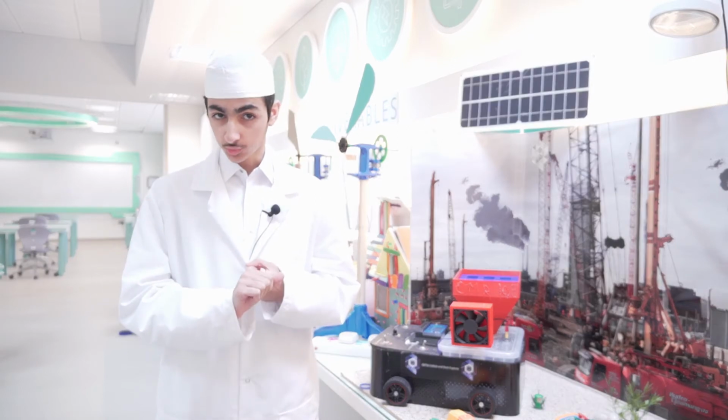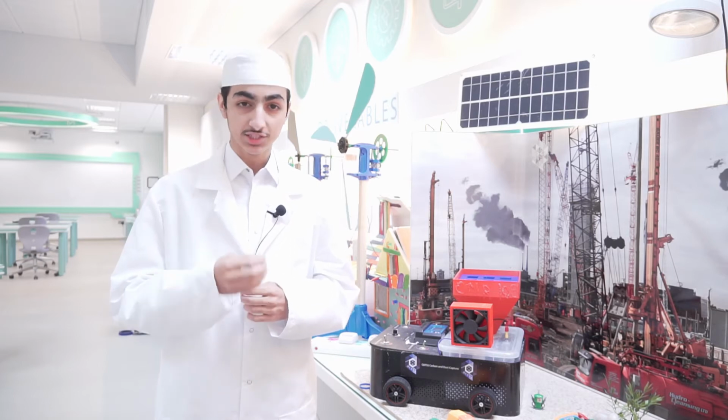The first part of our wheelchair is the movement part. And so how did we do that? Well, we first coded the eye tracking. So we used a mixture of CNN models, convolutional neural networks, and OpenCV face detection, also DLib's face predictor model to accomplish this task. And so what the code does is, first it uses DLib's shape predictor model to take an outline of the user's face. So DLib's predictor has 68 key points on the face.